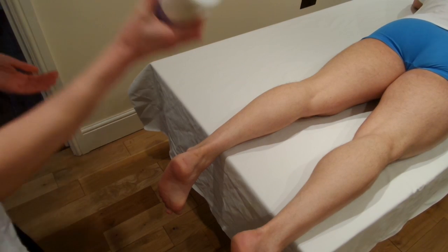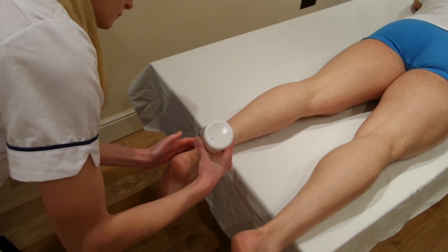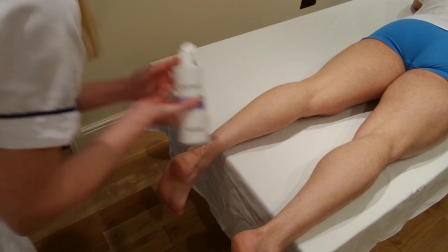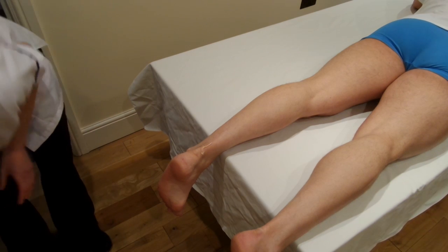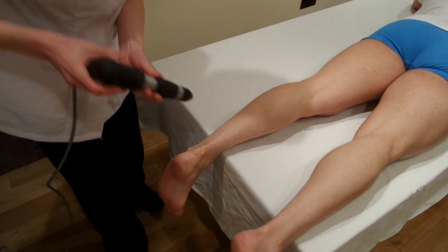Here we are with the Achilles tendon. This is for Achilles tendonitis. Apply some gel as a contact medium and then we're going to bring the shockwave machine in.